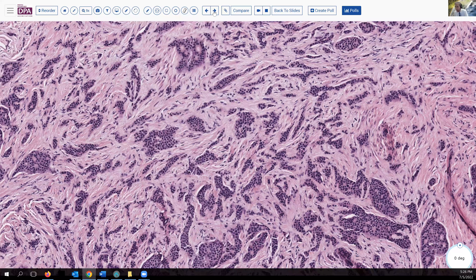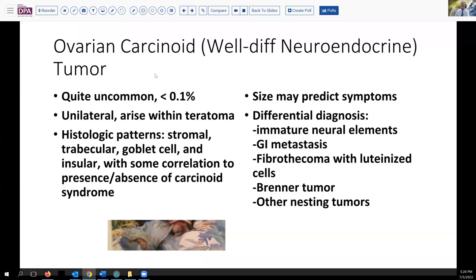Let's touch base a little about ovarian carcinoid or neuroendocrine tumors. These are really quite uncommon — you may not encounter one in your practice. Less than a tenth of a percent of ovarian tumors, and these are usually unilateral, arising within a teratoma. Traditionally, we've identified four different patterns: the stromal pattern, the trabecular pattern, goblet cell carcinoids, and so-called insular carcinoids, which would be more like this, although it does have a little bit of a trabecular pattern.